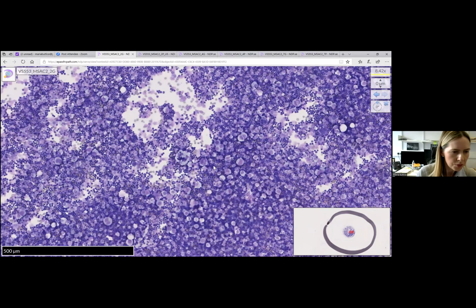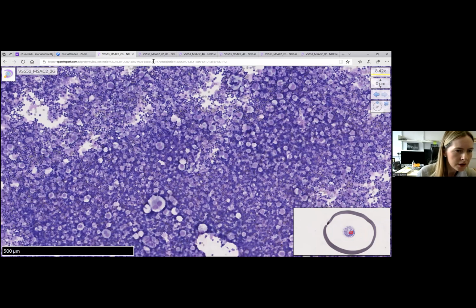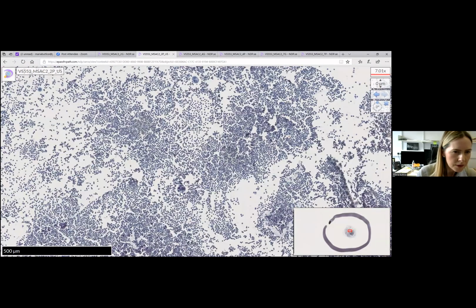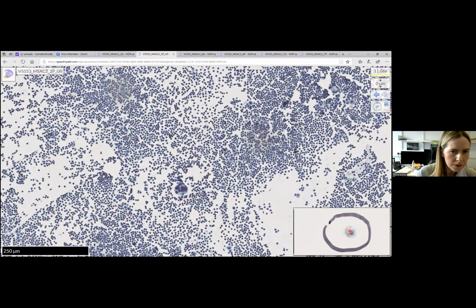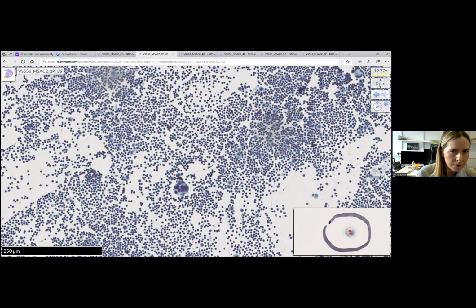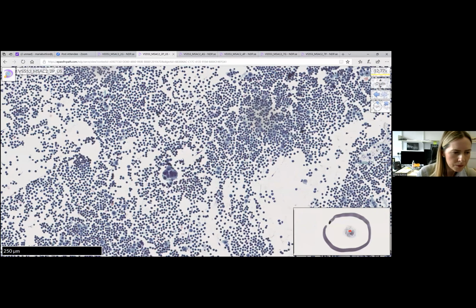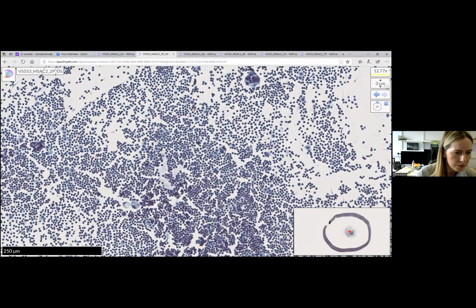And then I will bring you on to the PAP to show you the background cells.